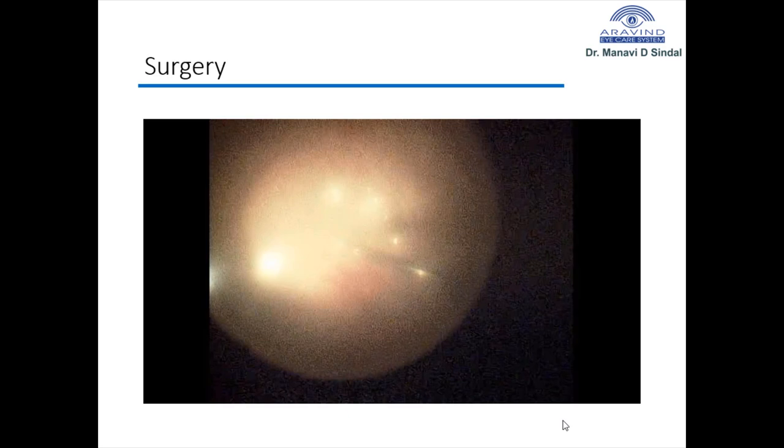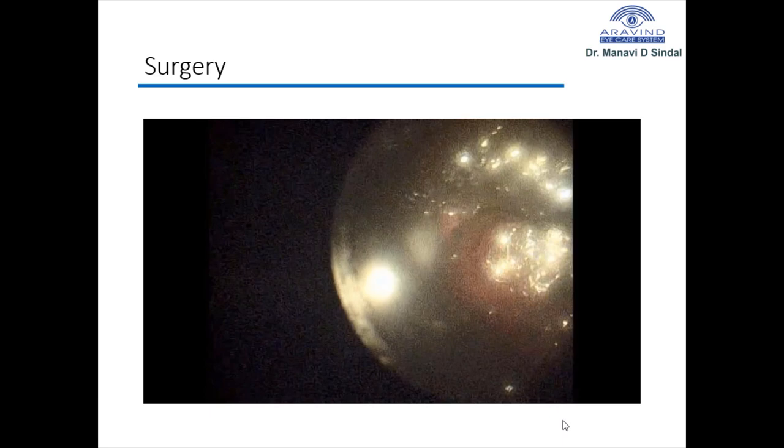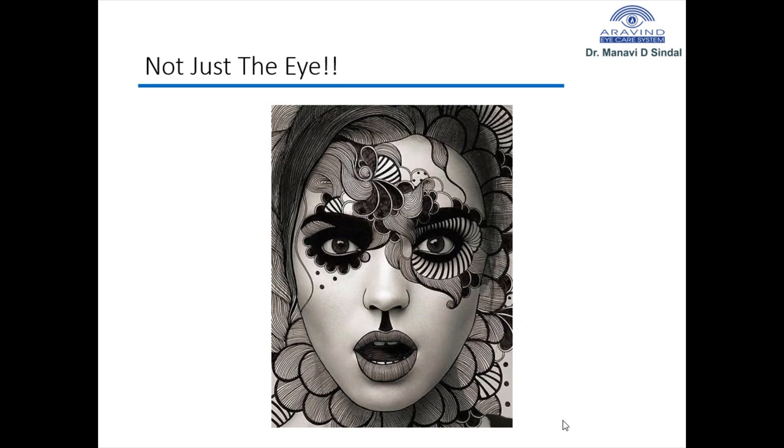And laser is now being done to the entire retina. And here after lasering the breaks which usually occur in such cases, now silicone oil has been filled in the retina for internal tamponade.